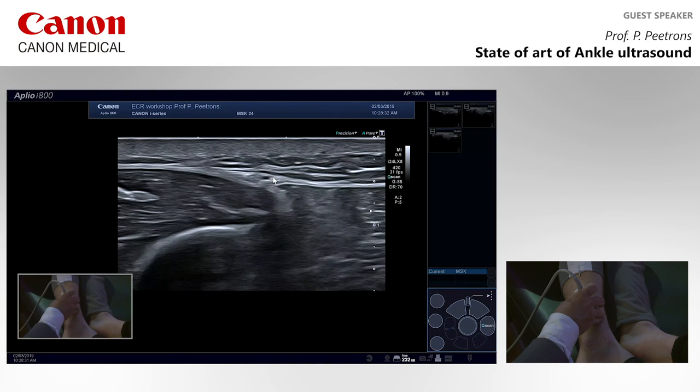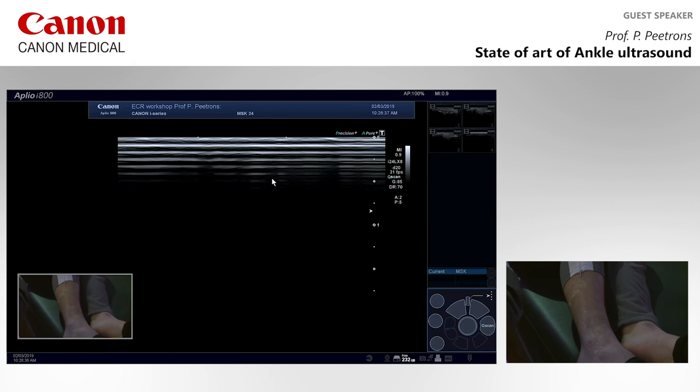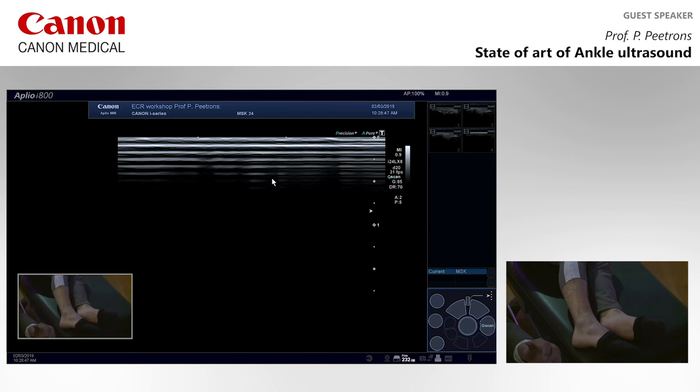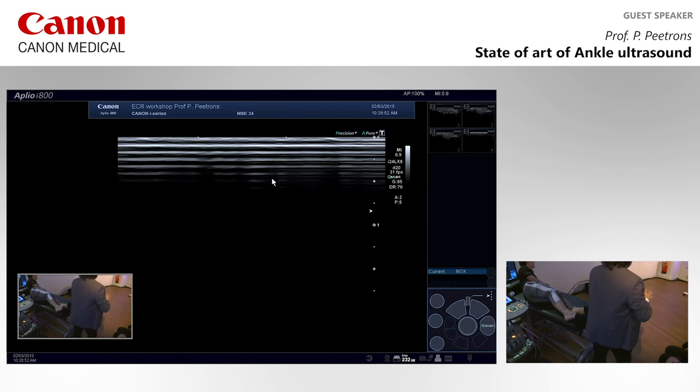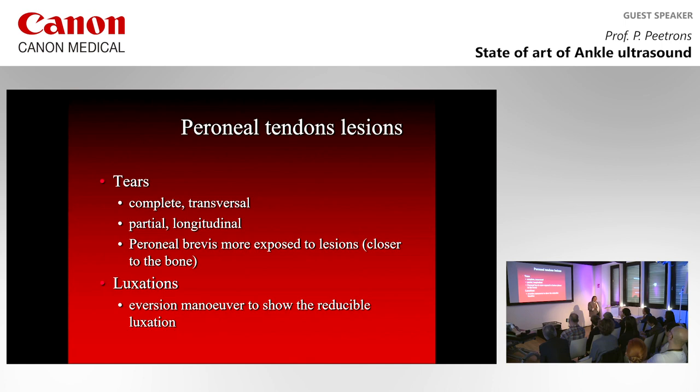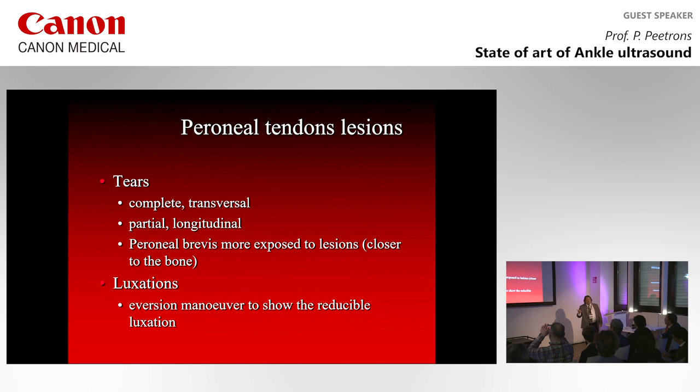And if you don't see anything in the ankle, don't forget that in recurrent sprain, so this is not the first sprain, it is coming after 5, 6, 7 little dislocations, okay? The patient is just, oh, it hurts. And then she says, or he says, that the pain is not precise in the ankle. It is going to the foot, to the dorsal foot. Of course, the dorsal foot is innervated by the superficial peroneal nerve. Then you have to think about looking at this.